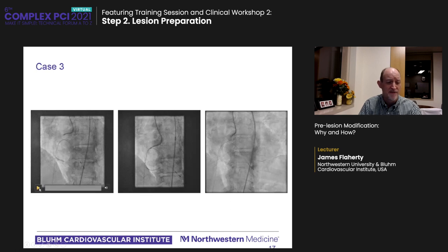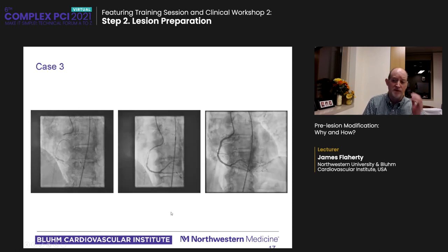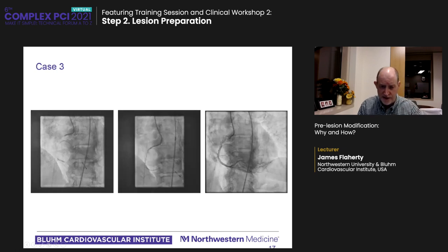This is a case of combined treatment with the intravascular lithotripsy balloon here. After treatment in several parts of the vessel and the use of a mother and child catheter, stenting became quite easy. And here you see a final result. So sometimes you have to use these tools together when you're doing adequate lesion preparation.